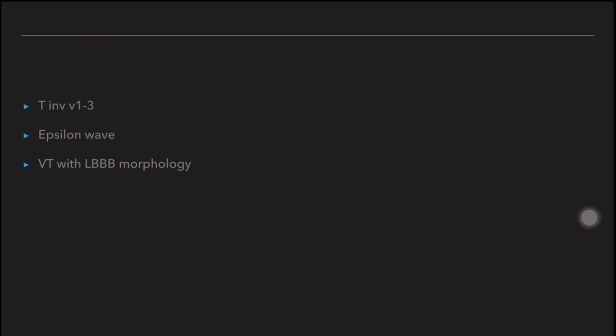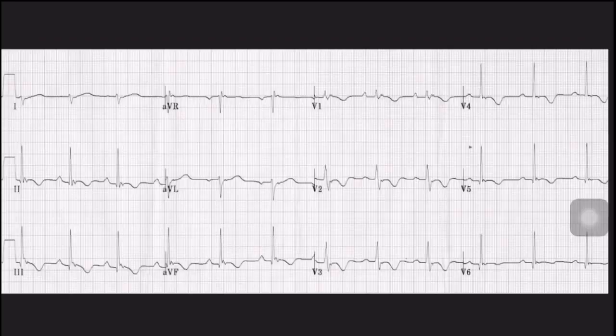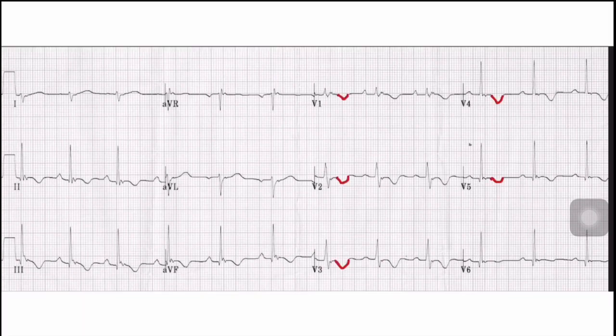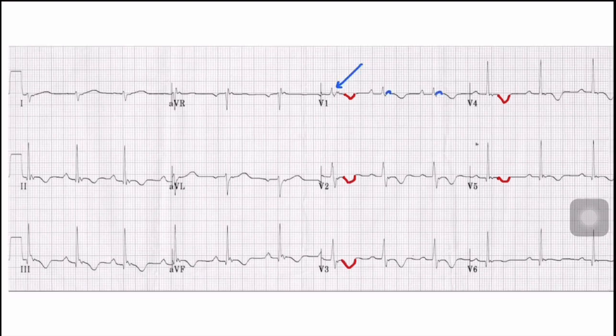It is the second most common cause of sudden cardiac death in young patients after HOCM. The typical ECG findings seen in ARVD patients are: T-wave inversions in V1 to V3, Epsilon wave, and typical ventricular tachycardia with left bundle branch morphology. In this ECG, we can see T-wave inversions in V1, V2, and V3, with extension into V4 and V5. The arrow here points towards the Epsilon wave.